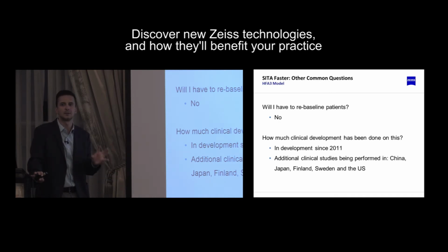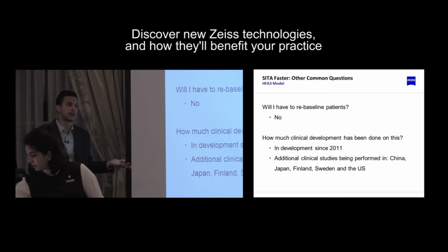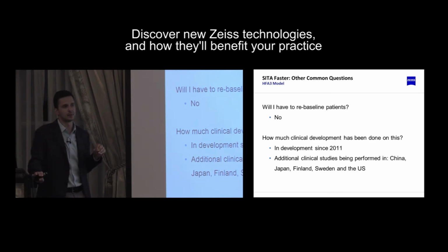And it's only available on the 24-2. If you're using a 30-2 on managing glaucoma, first question I would ask you is why? What are you going to catch with those other degrees that are on the other side of the nerve? You're not. There's been no significant clinical study that shows there's any value there. So if you're doing a 30-2, you don't need that for glaucoma detection or management. 24-2 is it. These are comparative over a period of time with your 24-2s and fit into the same algorithm as is already in your HFA3.